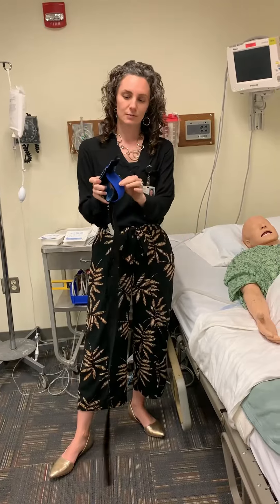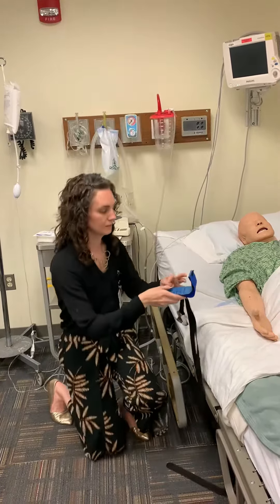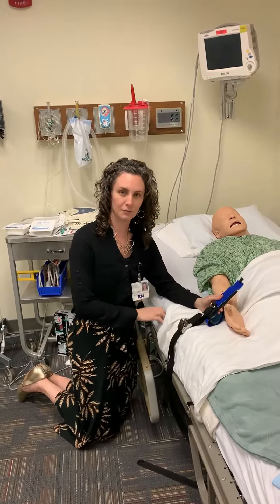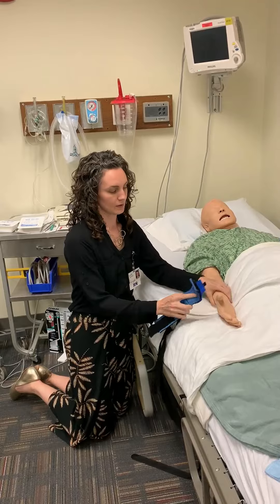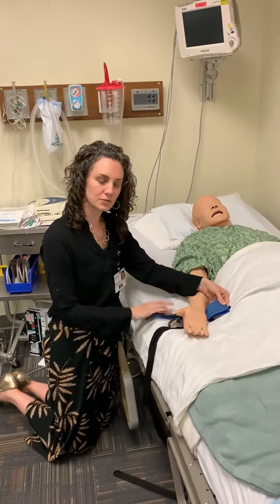To apply this to the patient's wrist, you're just going to open up your cuff. When you put this down, it's helpful to make sure that your buckle is facing up. That way when you go to unlock it later, your buckle's not upside down in the bed. Put your patient's wrist right in here — the soft part goes to their skin.